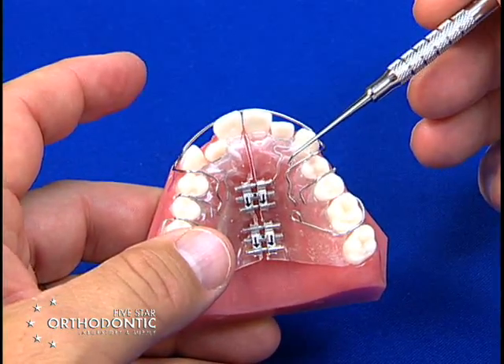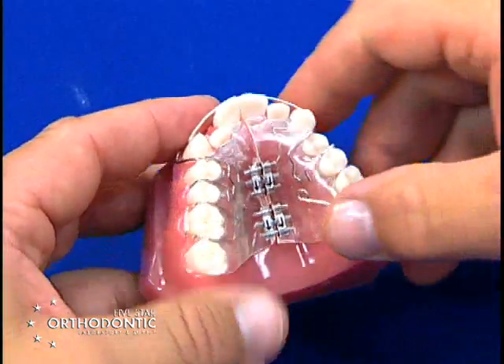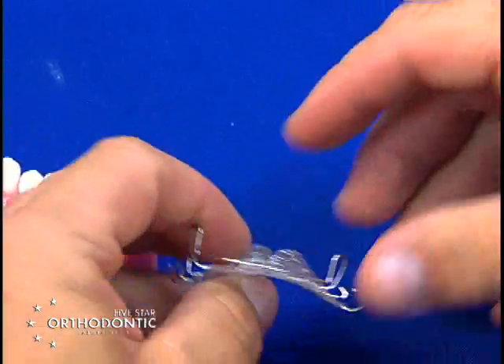If you do not want the anterior teeth to retract, you take a flat-on-flat to take the bow out of contact.